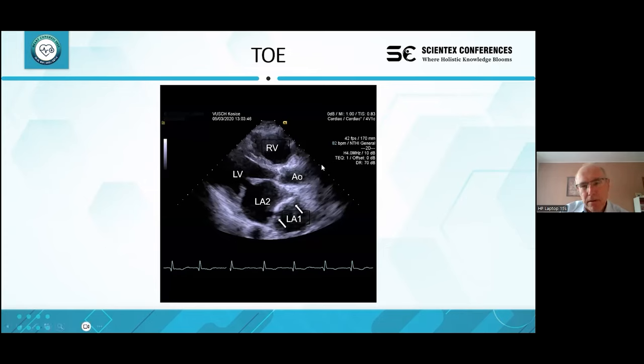the single departments of the heart: right ventricle, left atrium, upper the mitral valve, and left atrium, upper the membrane. Here is the membrane splitting the left atrium into two departments. And here is the aorta.